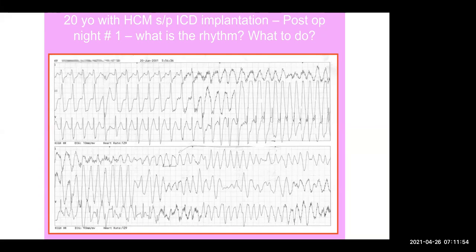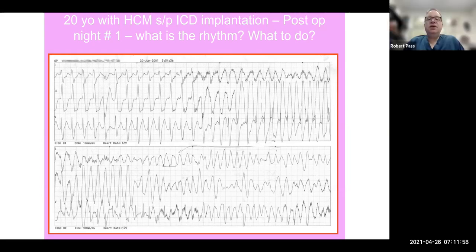If the lead has moved, it's post-op night 1. What do you think is wrong with the lead? I agree, it could have moved, but why would movement of the lead potentially be a problem? And I agree with you, it could be a problem. Although I'll remind you that this was a generator change. This was not a new system. But if it were a new system, that would certainly be a very significant concern.